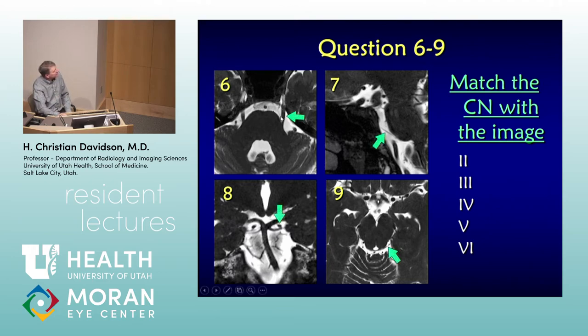So what's this nerve here? So 5 is the easiest one to see. It's a big fat chunk. As it comes in toward this little CSF space here, you'll sometimes see the fibers start to separate. So you'll often see little individual fibers kind of floating within the CSF right there. What is this CSF pocket here called? That's Meckel's cave.